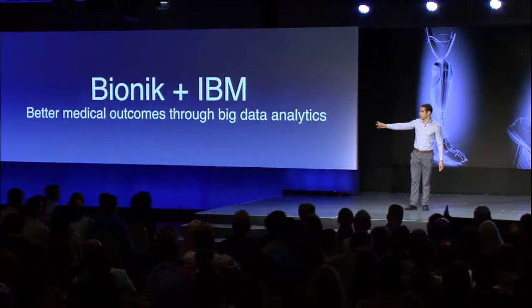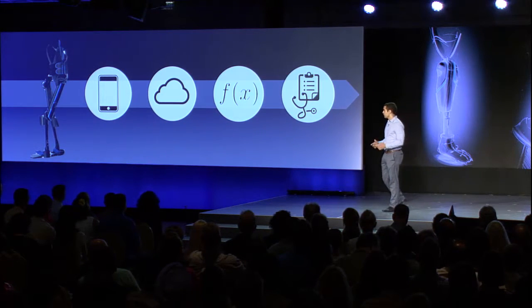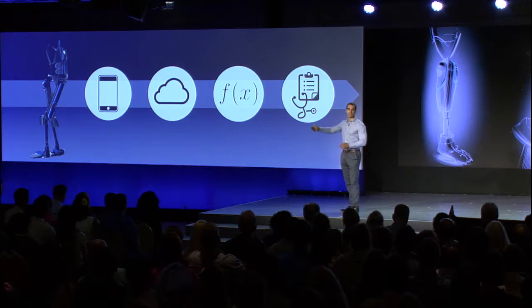We started working on our first project, and I have a diagram to show the data flow of the project. It's a simple project, but very complex. The project starts with the exoskeleton. The exoskeleton is a rehabilitation product, so we have a lot of sensors in the device. The paraplegic would wear this product. And even as the paraplegic is taking steps, doing a rehabilitation session, we can save the amount of data. For example, how many steps are taken, like the Fitbit. We can send that data to a tablet.